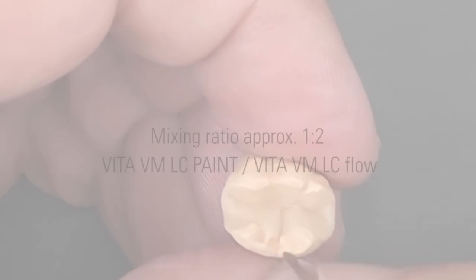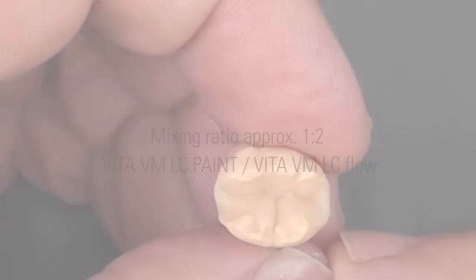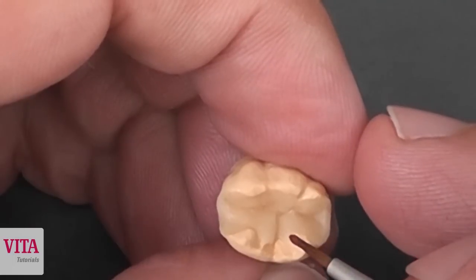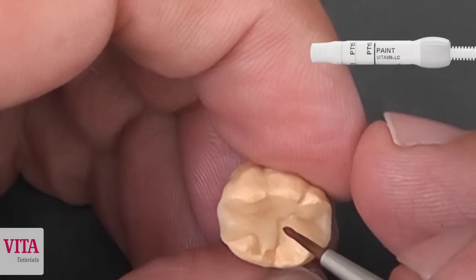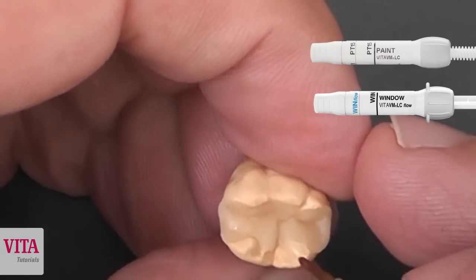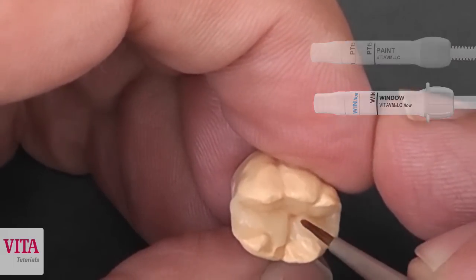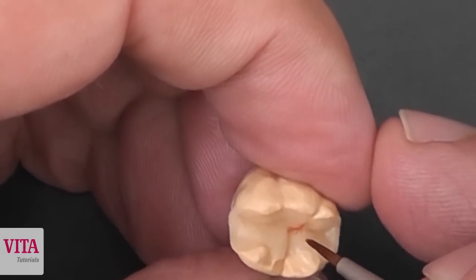The next step is the characterization of the fissure. What we use is mostly PT15. This is a brown paint material and we mix it again with a window. This is for the fissure staining.